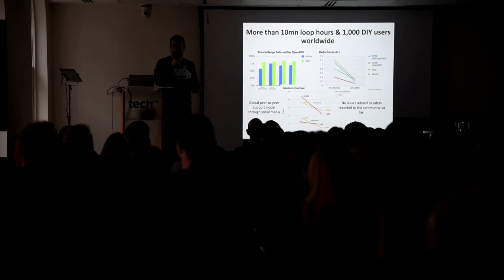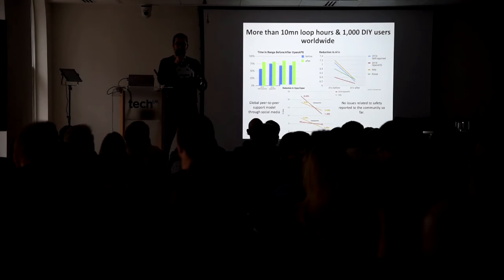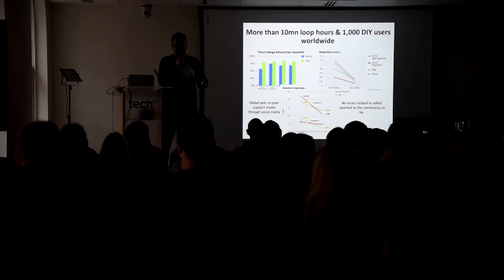And still, so far, we've not had any major safety issues reported, so what would be classed as adverse effects in clinical trials. That may be because people report things differently, or it may be because people don't feel that things are that bad an effect. But so far, one thing we can say is nobody's died using these systems.